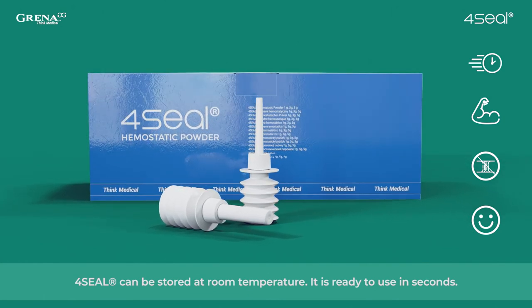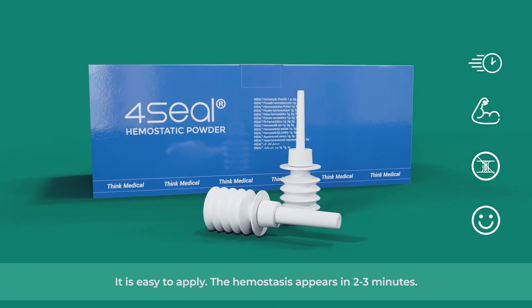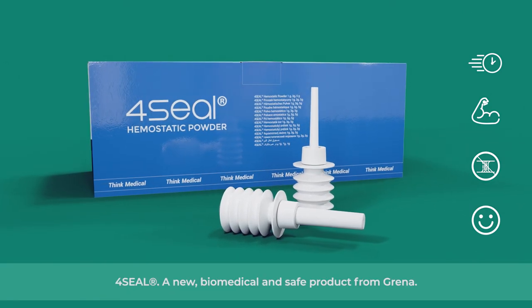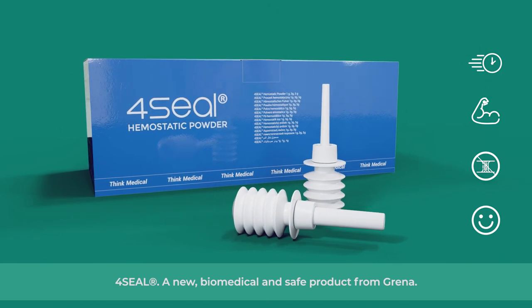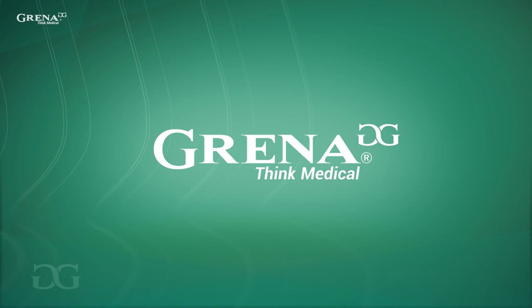4Seal can be stored at room temperature. It is ready to use in seconds. It is easy to apply. The hemostasis appears in 2 to 3 minutes. 4Seal, a new biomedical and safe product from Grena. Think medical.